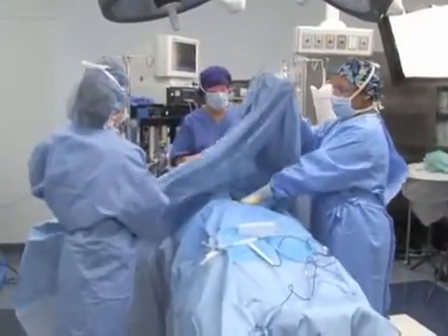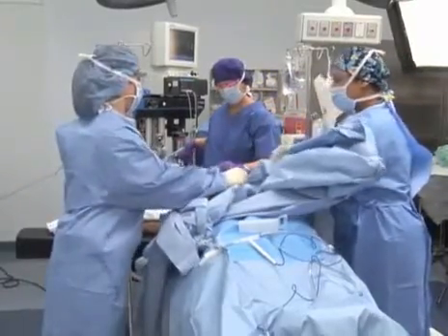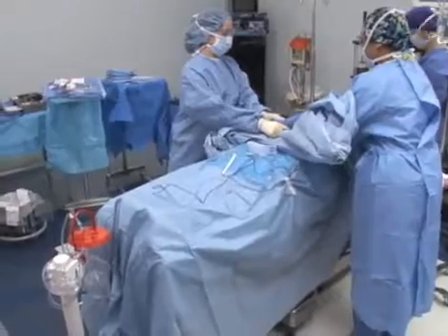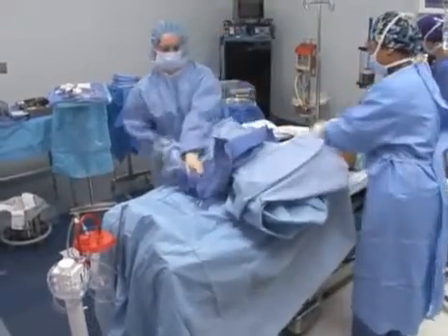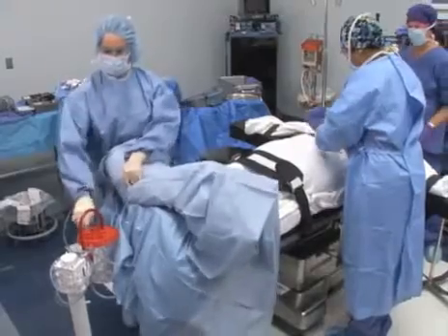One member of the sterile team holds any dressings in place while the drapes are slowly removed. When removing the drapes, hold them away from the patient, starting at the patient's head. Begin rolling them and proceed downward toward the feet. Be careful not to dislodge any wound drains.